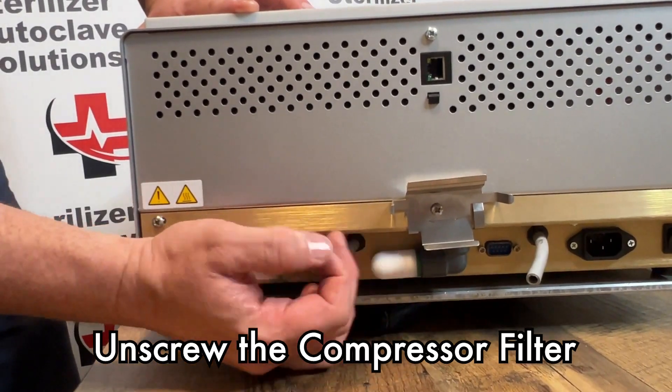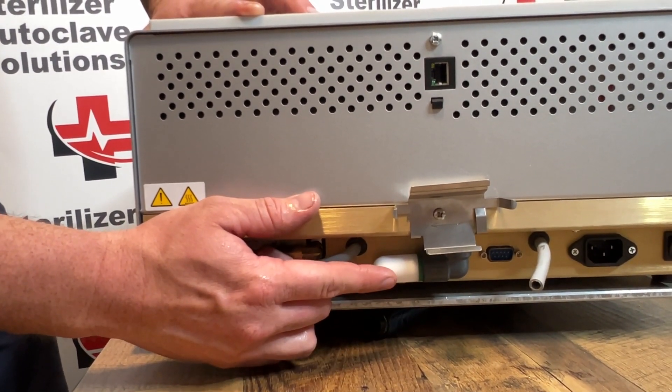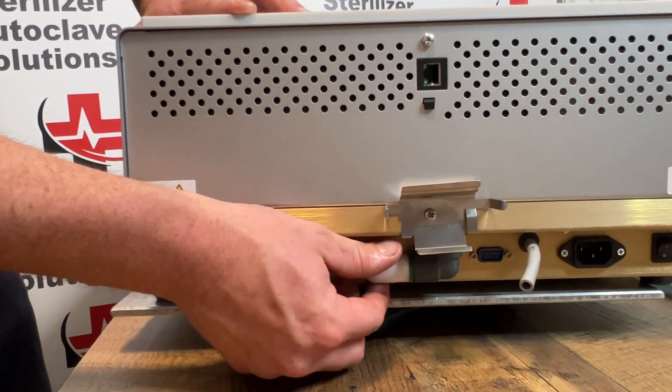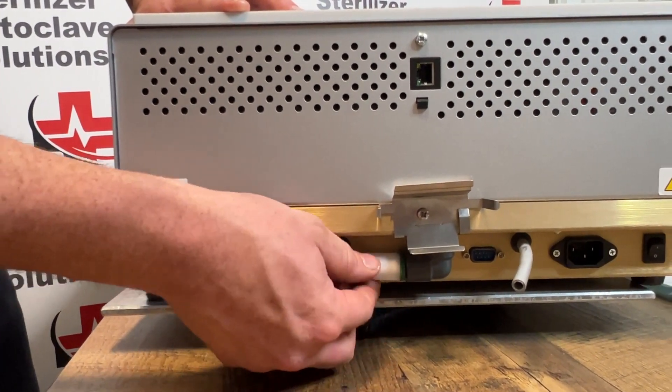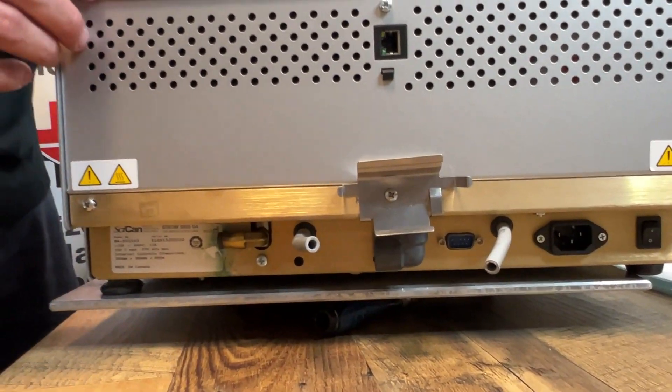We are going to remove your compressor filter. Not all STATUMs have a compressor filter. If you do, it will be located directly underneath your biofilter. This will simply unscrew and we are changing that for the PM.